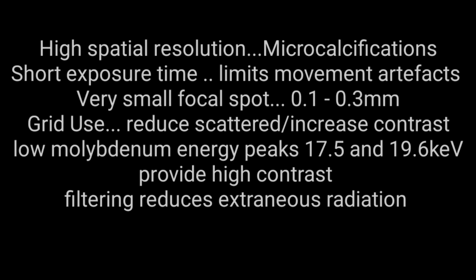There is scattered radiation which affects the quality of the image, and besides this, if you use the grid, it will also increase the contrast. There is always a narrow range of inherent breast densities, because the breast is predominantly fatty tissue. Because of the fatty tissues, it has a narrow range of inherent breast density.